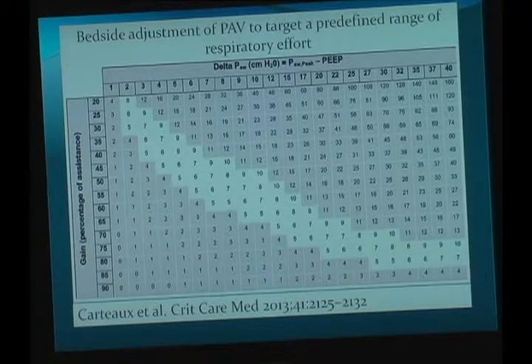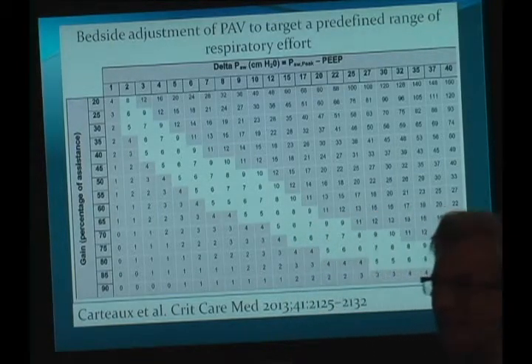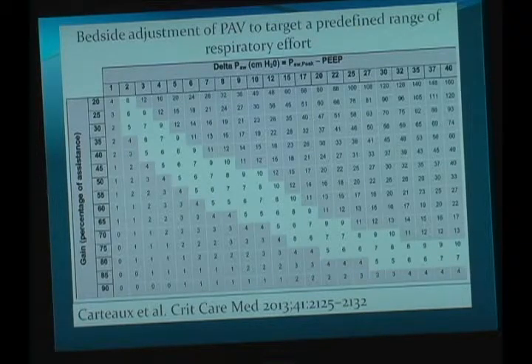And the other one is, how can you decide the amount of help that the patient needs? Do you have any bias about that? Always some amount of help? Always 100% of help? No, usually between 50 and 70% we start. Between 50 and 70 will be your start, but based on what approach, do you mean that maybe 50% is enough for the spontaneous patient to sustain in the long term? We're trying for a work of breathing below 0.5 joules, because the machine also offers some kind of work of breathing. Yeah. So whatever support we need for that.